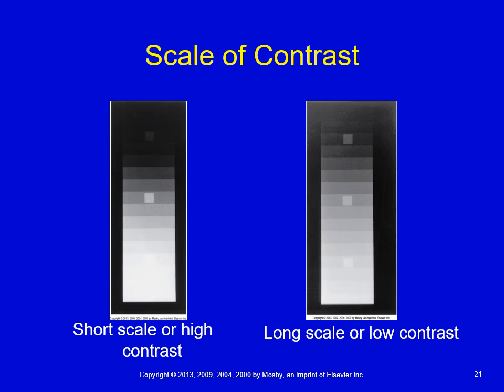You can see where the different body parts are and the different portions of the bowel are based on the fact that you know anatomy, but you can't say for sure where they sit and how they move unless we gave that person some contrast. Everything is just a blur in terms of a shade of gray, a different shade of gray.